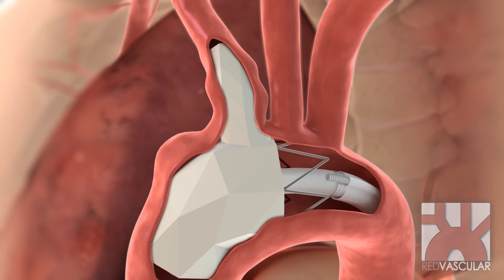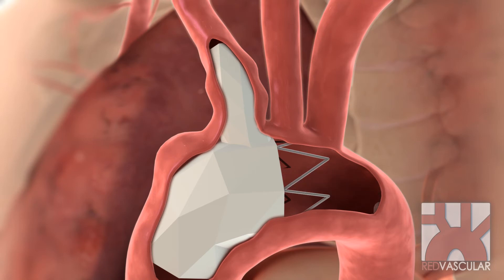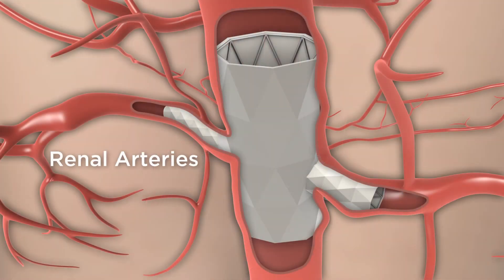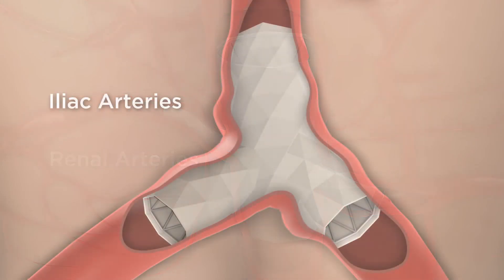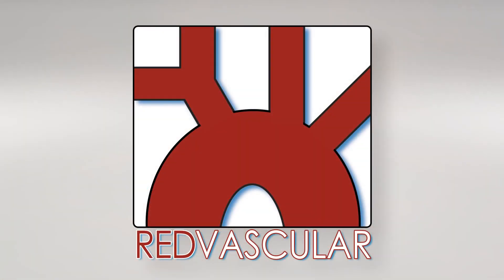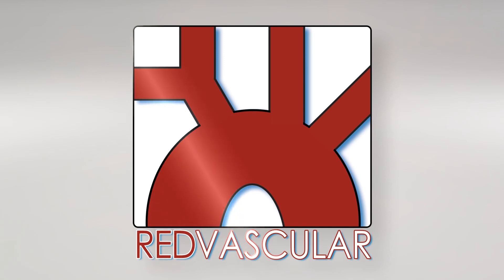At the end of the procedure, the delivery tube and guide wires are removed. The Red Vascular Branch Endograft System is also well-suited for treatment of aortic aneurysms involving the renal arteries, the common iliac arteries, or any other major branch of the aorta, including the superior mesenteric or hepatic artery.